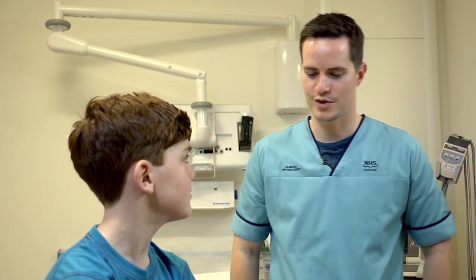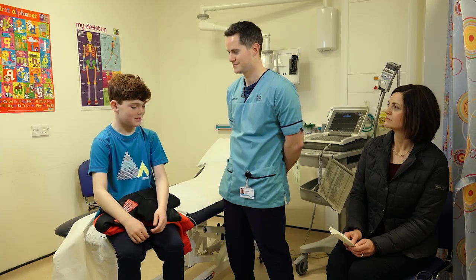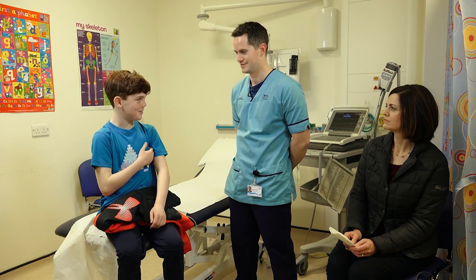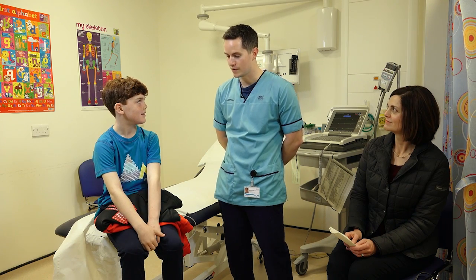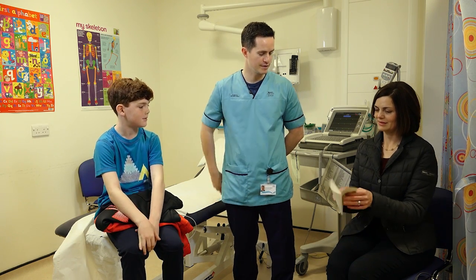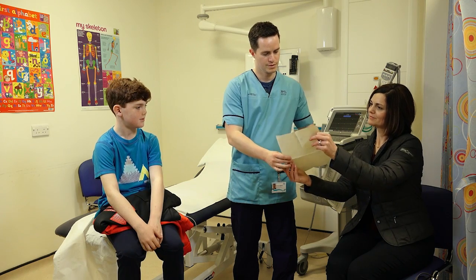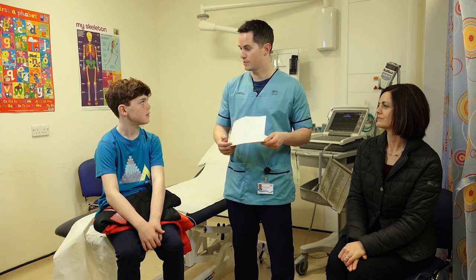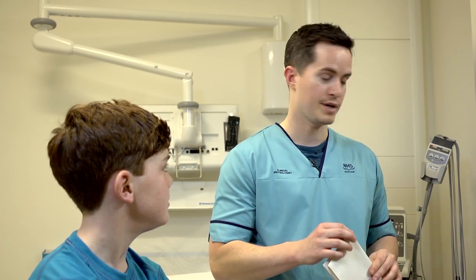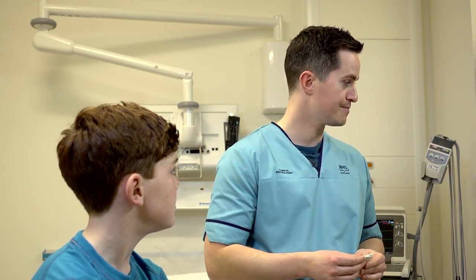Hello again Sam. How did you get on with the monitor? One of the stickers fell off but my mum put it back on. Oh that's good. Were you able to fill in the diary? Did you have any symptoms? Excellent, thank you for filling that out. What will happen now is we will analyse the tape and send the results back to the doctor who asked for it.